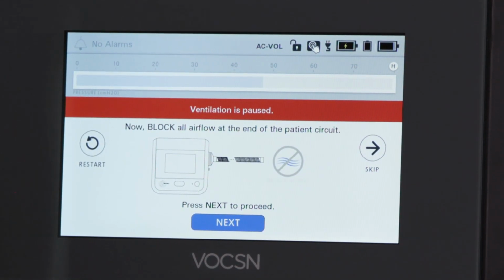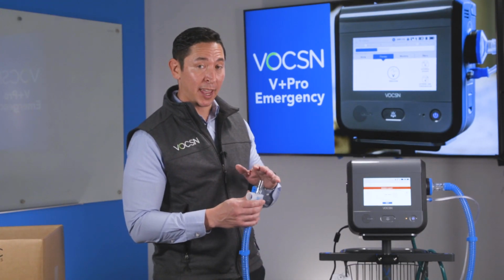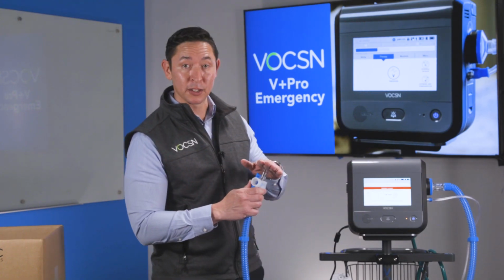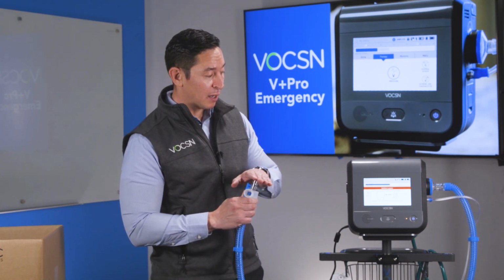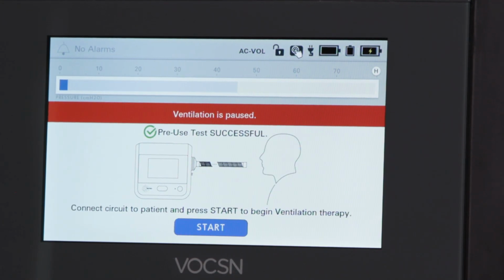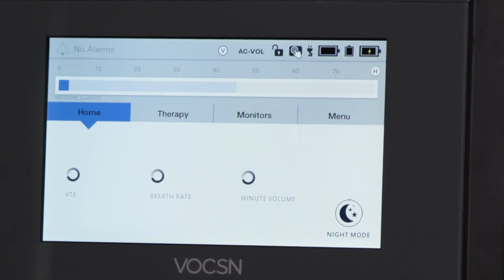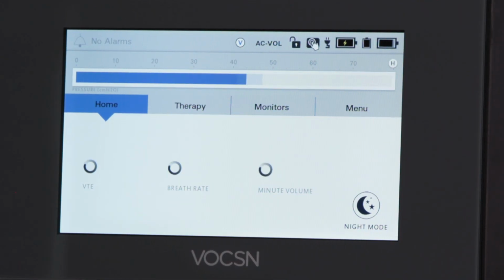This next step, it says to block the end of the circuit. I have a demonstration circuit right here, so I'm just going to cover it with my hand, but if you had a brand new circuit, you'd probably want to use a clean gloved hand. So I'm simply going to hit next and just block the end of the circuit. This step is measuring the compliance. So we've got a green check mark. That's telling us that we had a successful pre-use test. So I can simply hit start and the ventilation's automatically going to resume. And then it's going to bring us to our main screen.